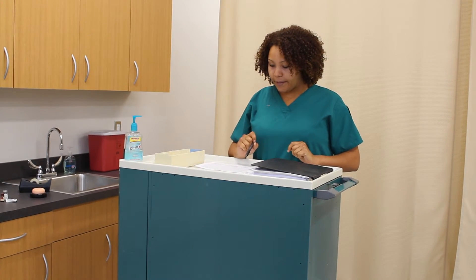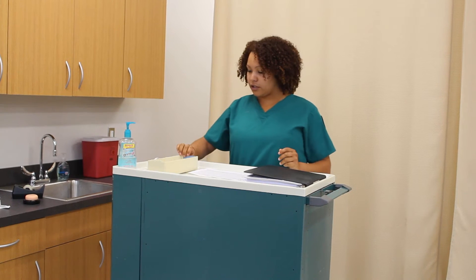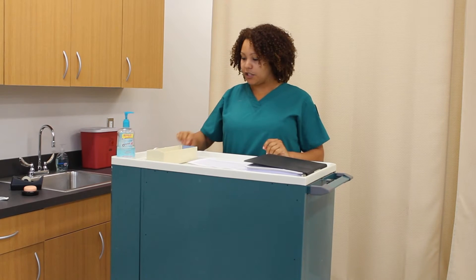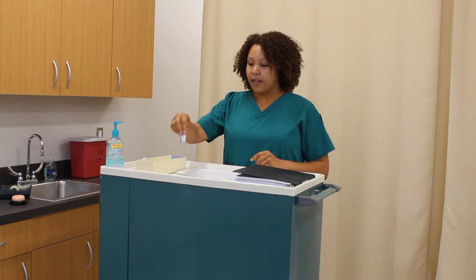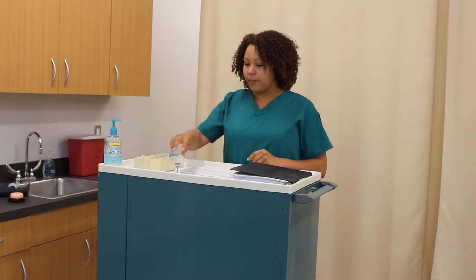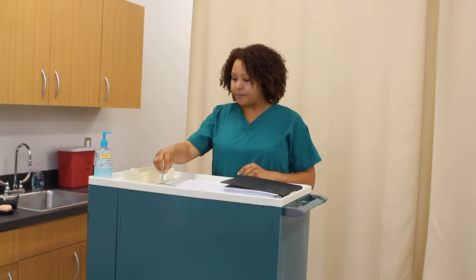I will begin my three checks on the medication. I've got the patient Josie Smith, and I've got her drawer out of the Pyxis machine. I have my heparin 10,000 units per milliliter, and the doctor ordered heparin 5,000 units. That's my first check — confirming I have the correct heparin.